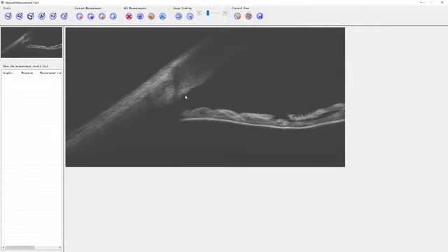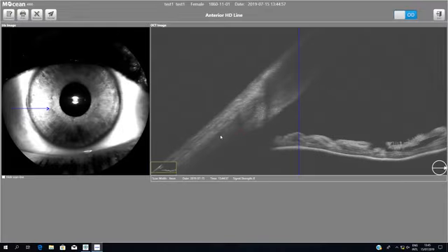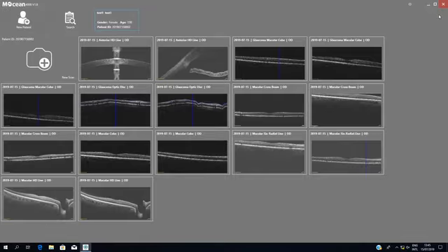And of course it is very important to measure the angle. You can measure the angle by pressing the angle button, and you have just 3 clicks. 1, 2, 3 clicks. With this procedure, you know how the angle measures. You click on the X in order to go back, and of course you can always save these changes or not. This is how we acquire the images from the angle, and if you want to go back to the previous screen, you click on Exit.